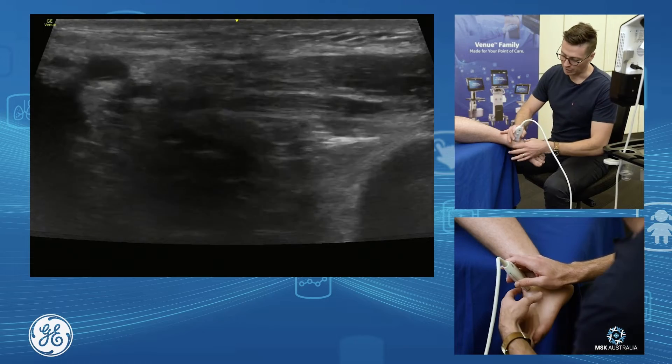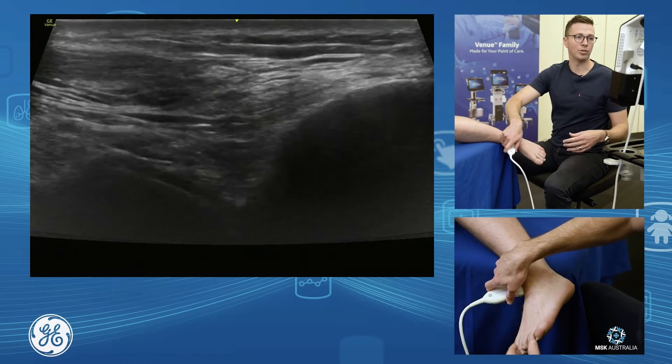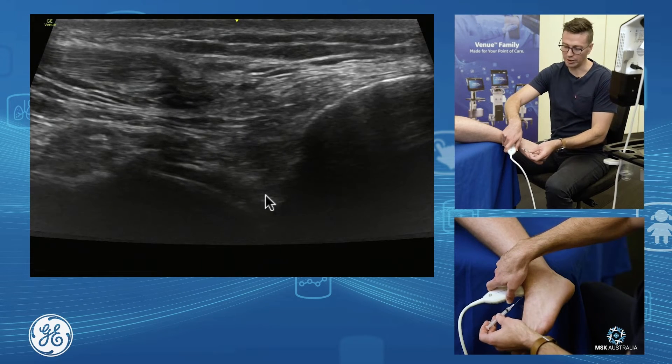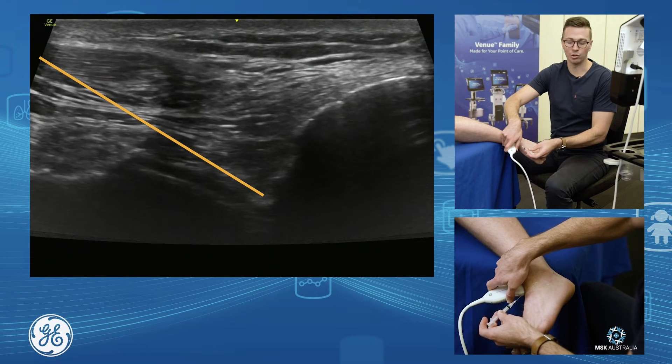There are many different ways of going about it. You can either go into the soft spot of the ankle — come around just medial to your tibialis anterior, find the front of your joint in through here, and introduce your needle down into the joint space, having your needle glide down into the joint.